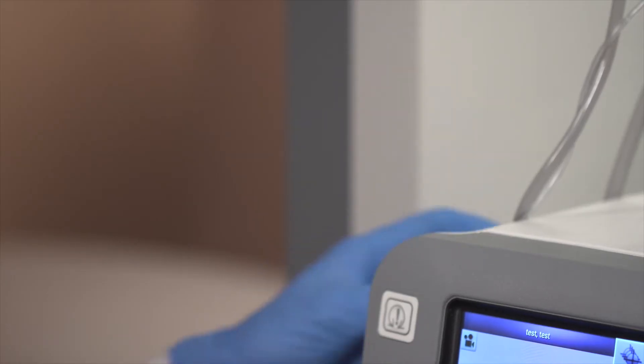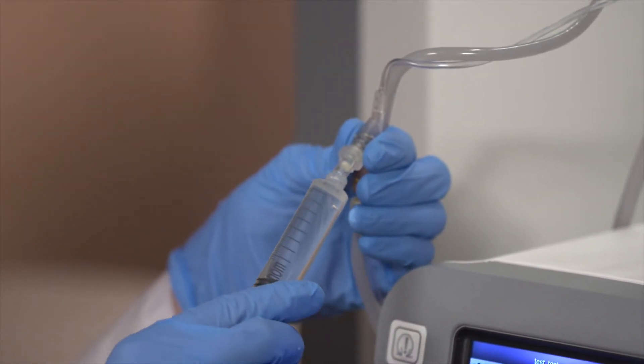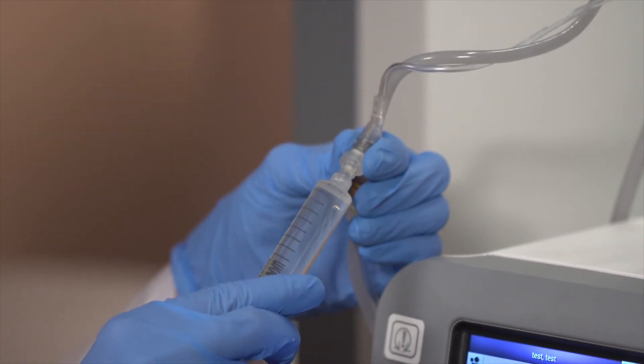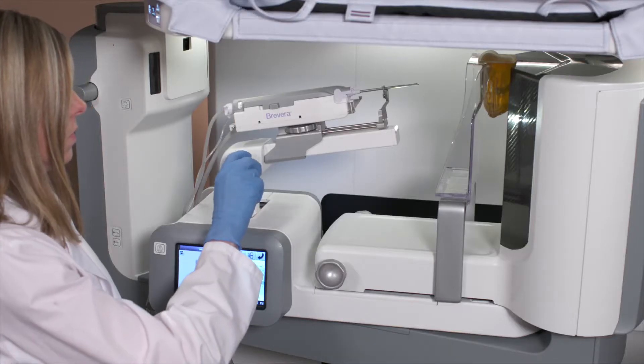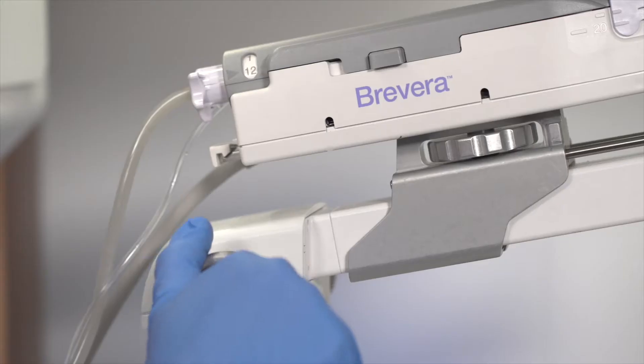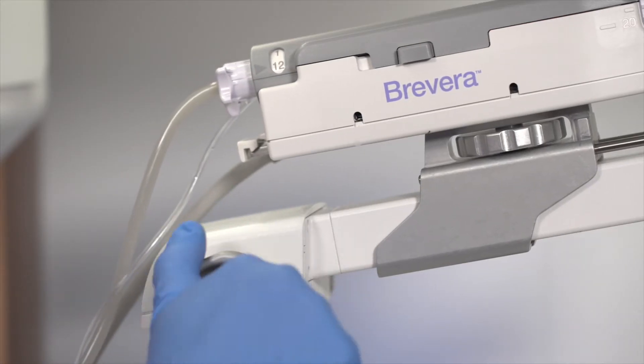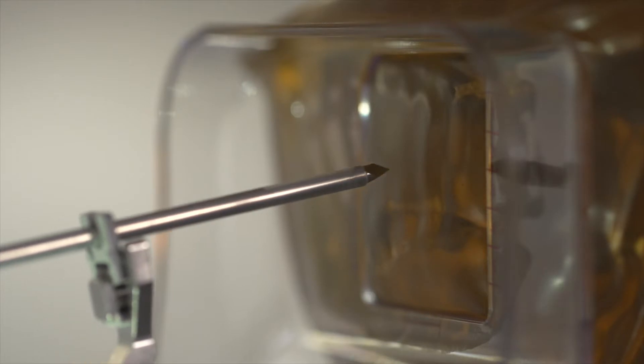If not already done, the physician may place a 10cc syringe of anesthetic on the Y-valve. This is done by simply twisting the lure lock syringe in place. The technologist or physician will clean the skin. Then, the physician will manually advance the tip of the needle close to the skin surface to ensure accurate anesthetic placement.